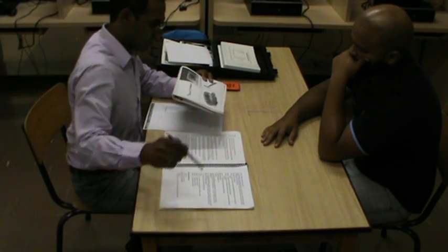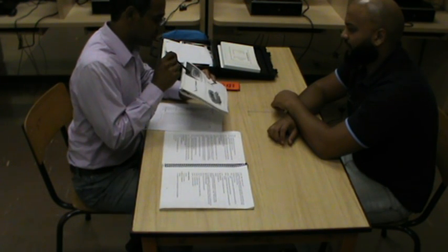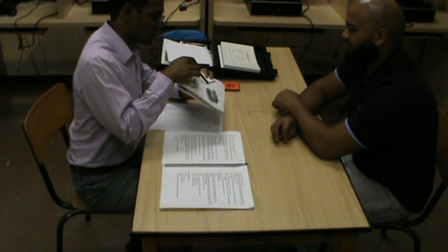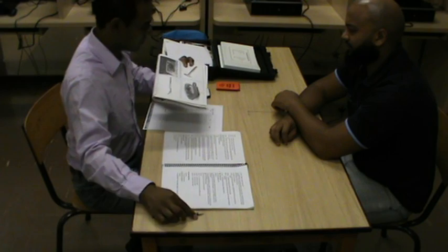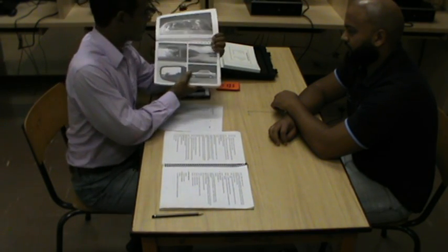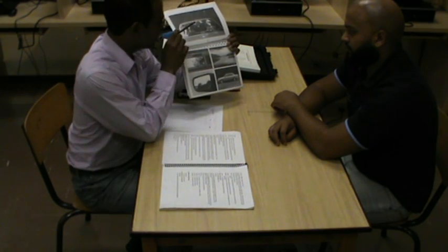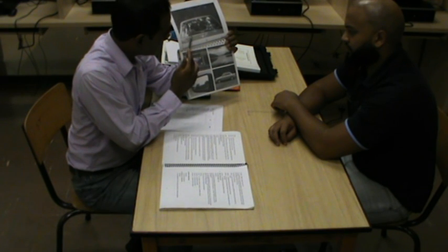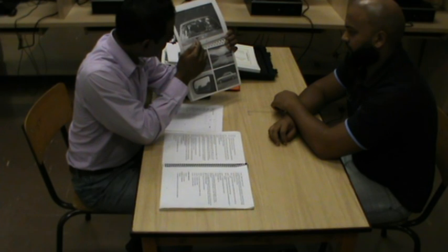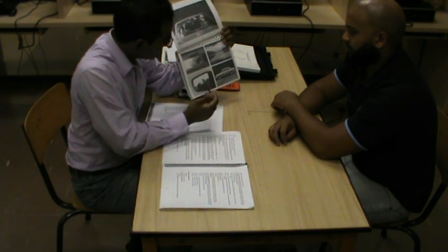Okay, so let's start off. Mr. X, what do you see over here? A fork. Over here, a back window of a car. Yes, over there, telephone. Okay, so let's just say Mr. X had a problem in expressing that. So you will show him the main picture and ask him to identify what he sees here at the bottom. Mr. X, do you see something similar to this picture over here at the bottom in these four pictures?